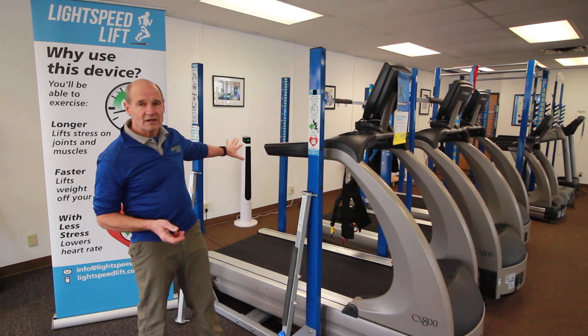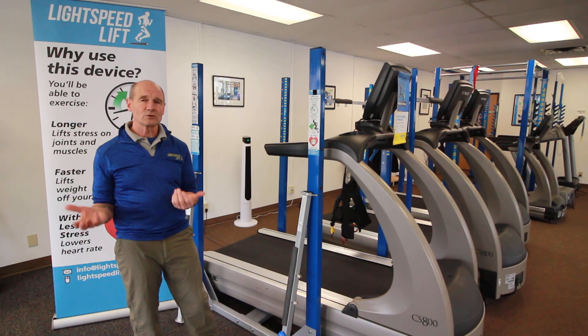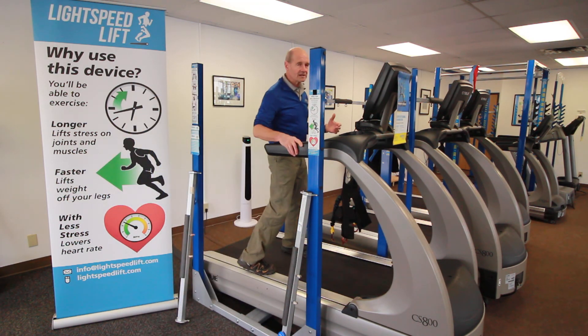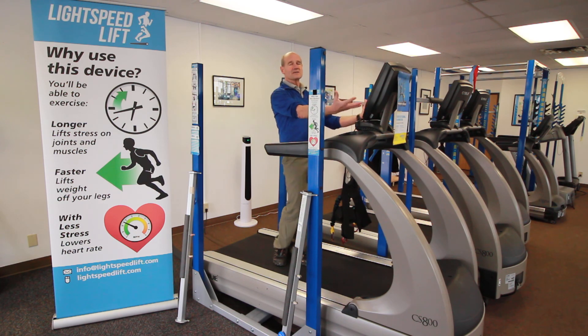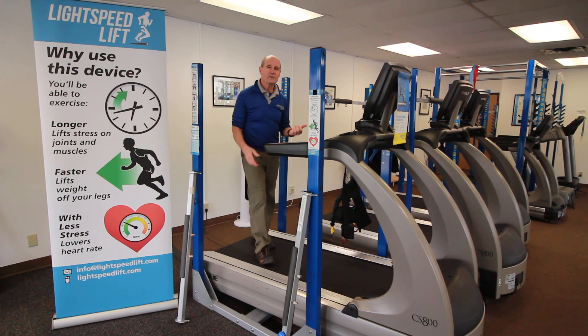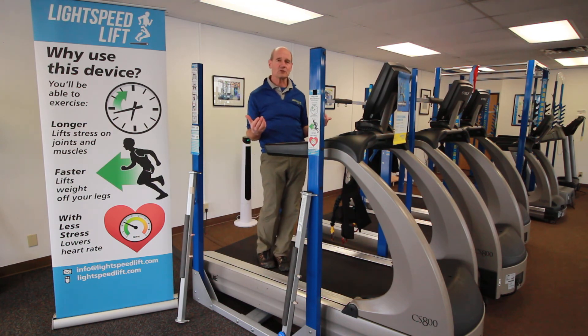Without any bars on, the treadmill is still totally your treadmill. I can get on the same way. I have access to the front. I can come in off the back. There's no impediment to me getting on and off the treadmill.